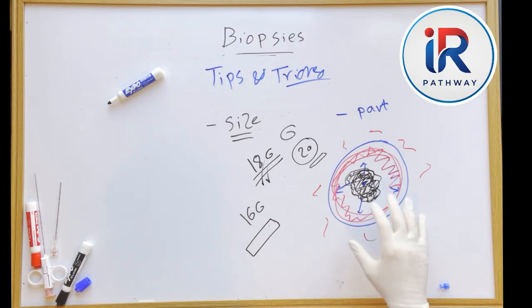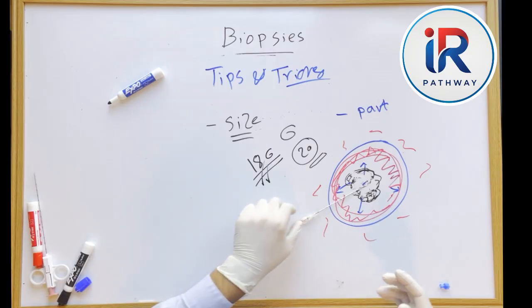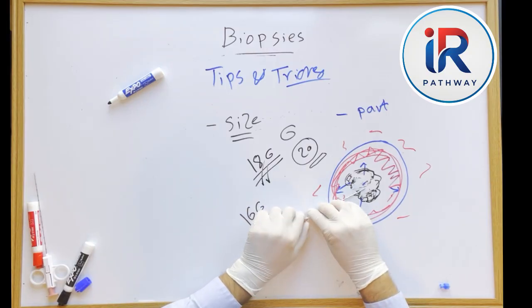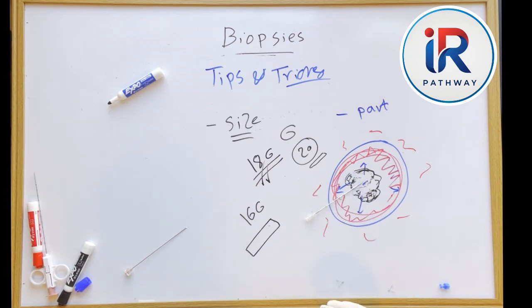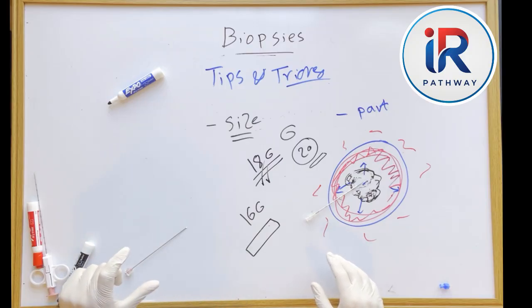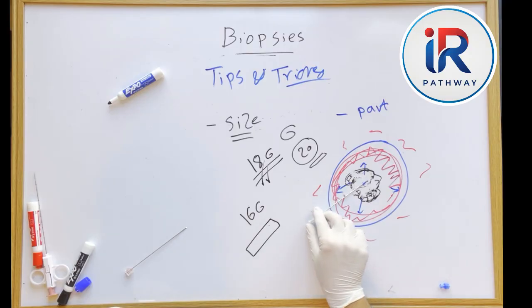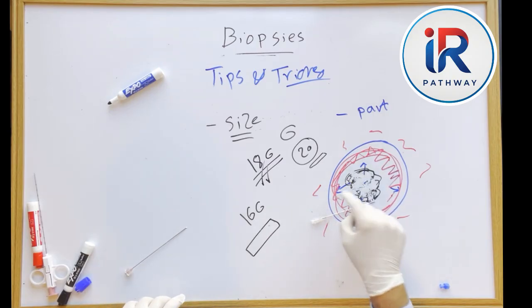Now, if the lesion was not like this, and you advance the coaxial needle, then on withdrawing the stylet, you notice fluid coming out. Since you are already in that position, the recommended approach is to connect the coaxial needle to a syringe and aspirate the fluid, say take around 5 cc. This sample can then be sent to the lab for cytology as it may be sufficient to identify the type of cancer. While you are in this location, you can also slightly adjust the position of the coaxial needle up, down, side to side to obtain samples from different areas.